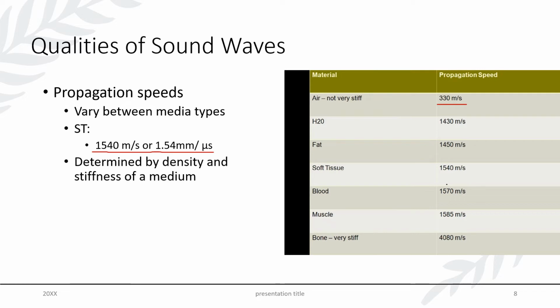So understanding how propagation speeds work, and which materials have variable propagation speeds, can help you utilize your ultrasound more effectively and identify areas where ultrasound may not be your approach of choice.